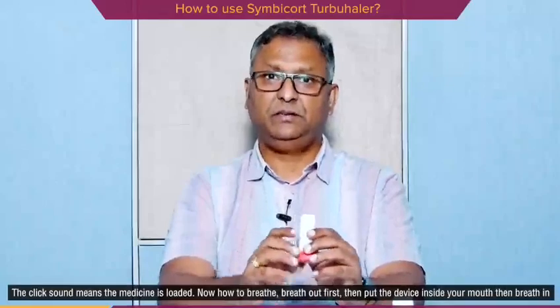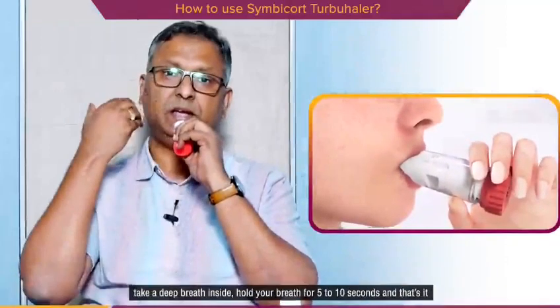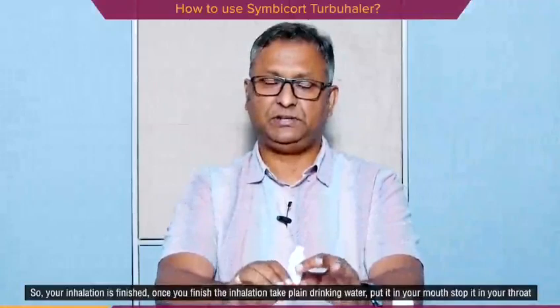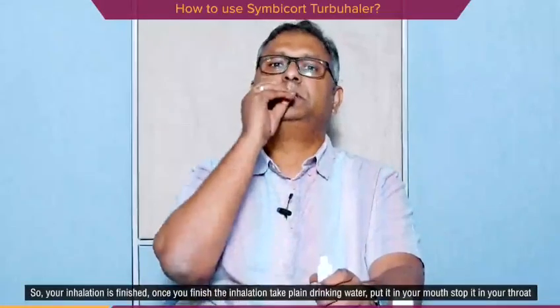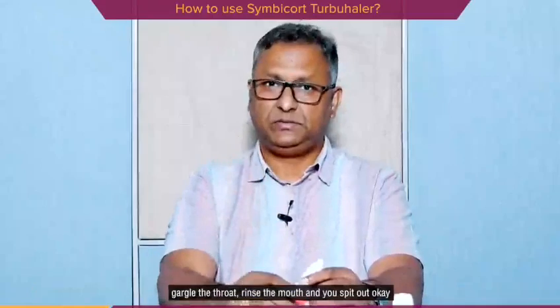Now, how to breathe? Breathe out first, then put the device inside your mouth and breathe in. Take a deep breath inside. Hold your breath for 5 to 10 seconds. And that's it. So your inhalation is finished. Once you finish the inhalation, take plain drinking water, put it in your mouth, gargle the throat, rinse the mouth, and spit it out.